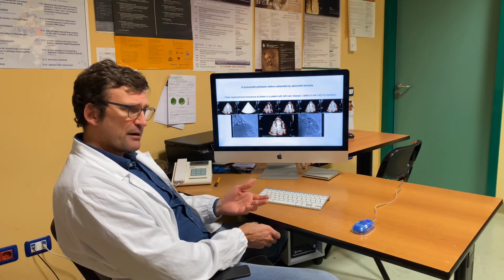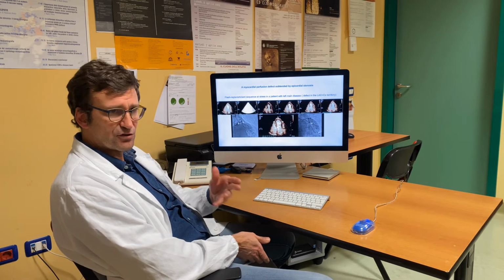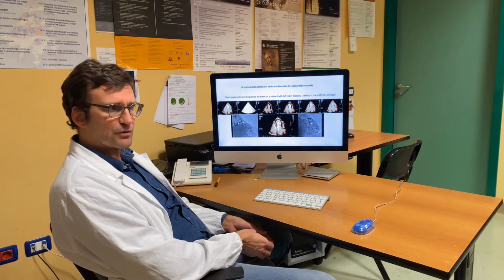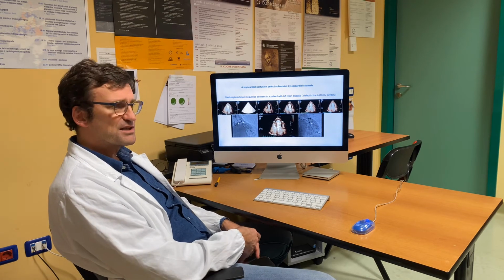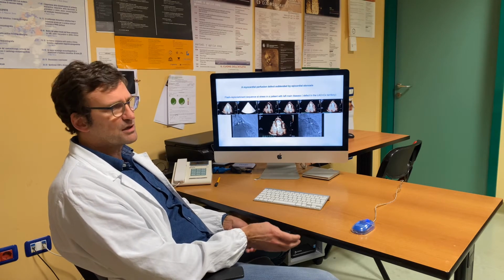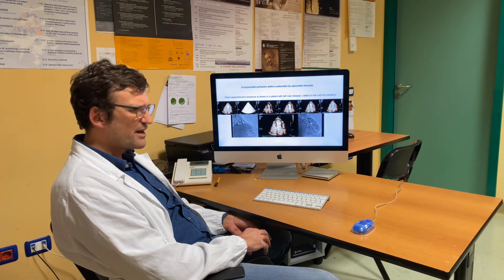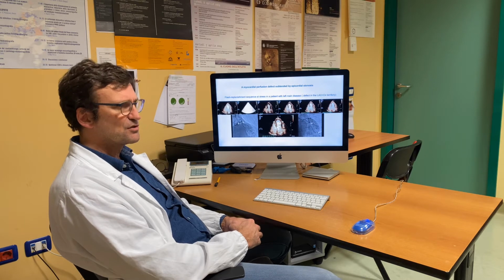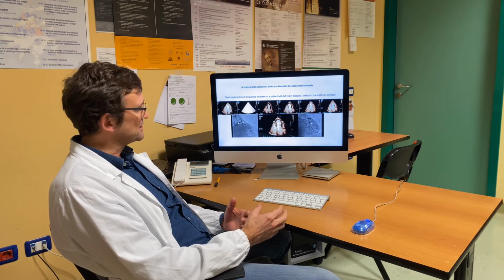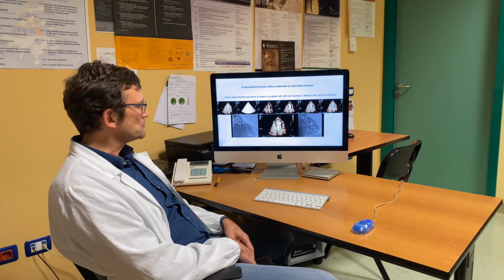So this is just one of the advantages of using contrast. I always say, and probably said to you a few years ago, that contrast is very helpful for three things during echo and stress echo in particular. So you can assess, first of all, wall motion as it should be, with perfect images where the endocardium is perfectly visible in the 17 segments. Then you have the CFR, which is a very important additional parameter to add on. And then perfusion, which is the most difficult to acquire, but it's satisfactory when you have good images. Do you have any example of myocardial perfusion?